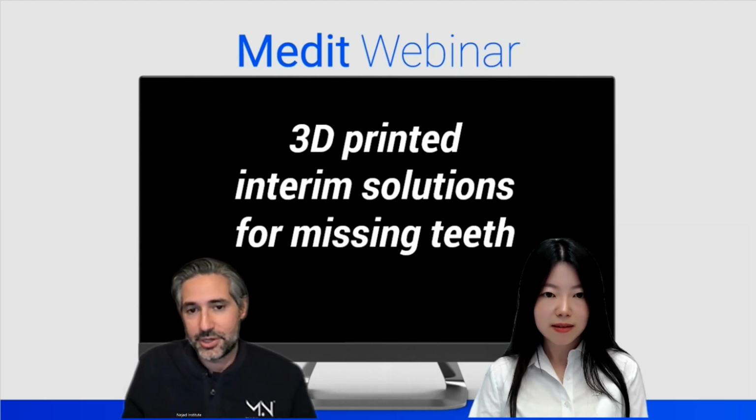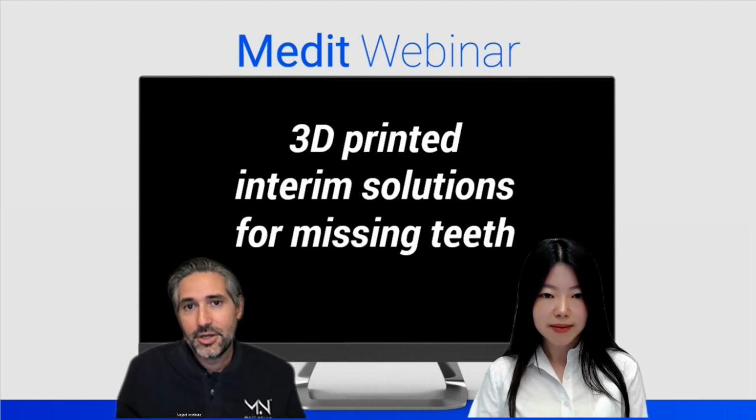Interim restorations and solutions are terms that can be used interchangeably, but basically the way I think about it is it's an intermediate solution, oftentimes a transitional appliance. I personally call provisionals things that are going to be shorter duration, and interims things that are going to be longer than a provisional or temporary, but less than a permanent.